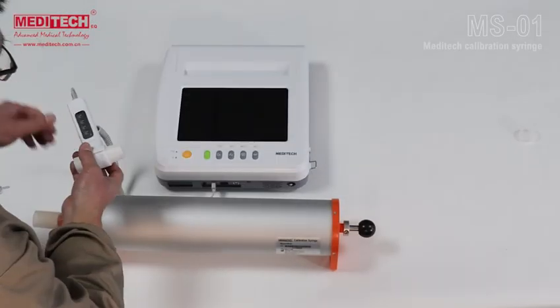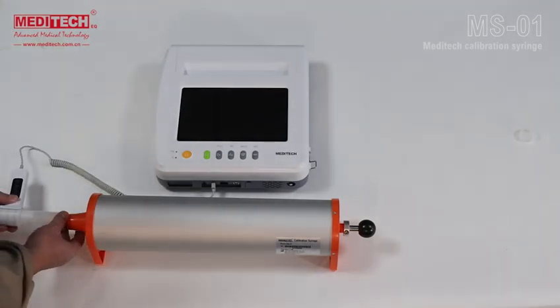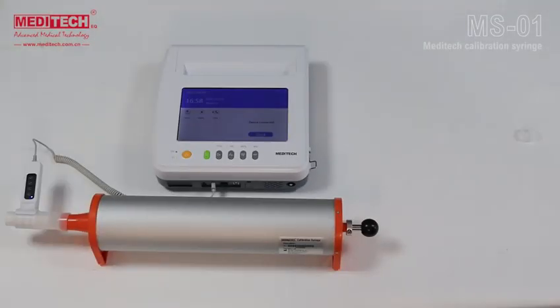Select the correct direction as shown and connect it to the silicone connector. After starting the device, the main menu will show that the device is connected.